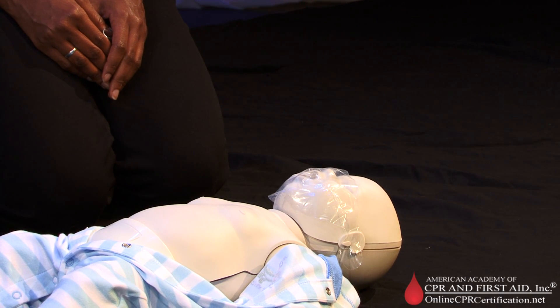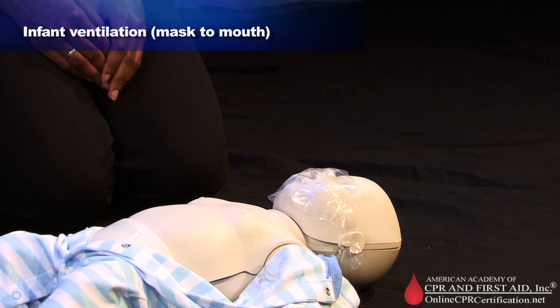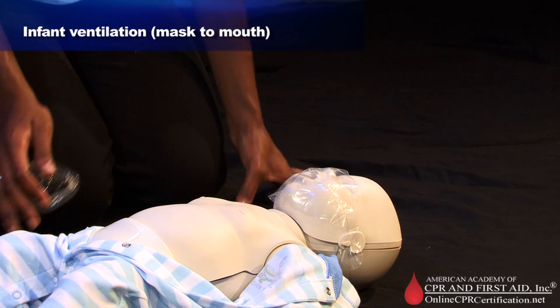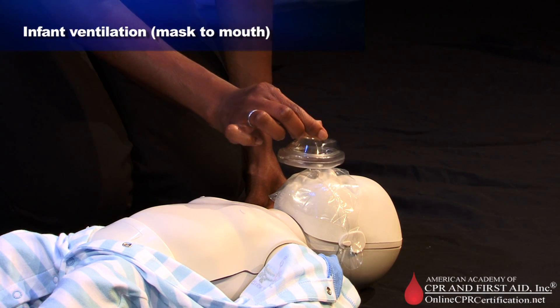In this video, you will learn the technique for mask-to-mouth breathing for an infant. Position yourself at the victim's side. Place the mask on the victim's face with the V-shape of the mask on the bridge of the nose.